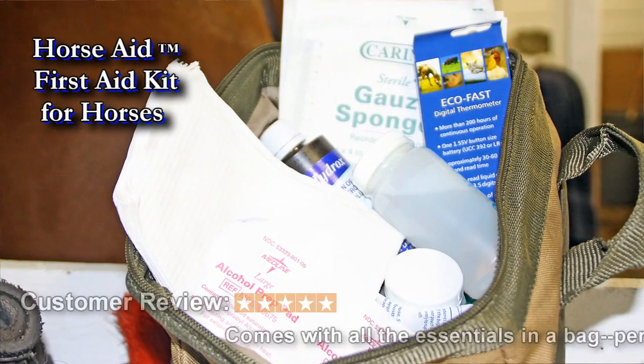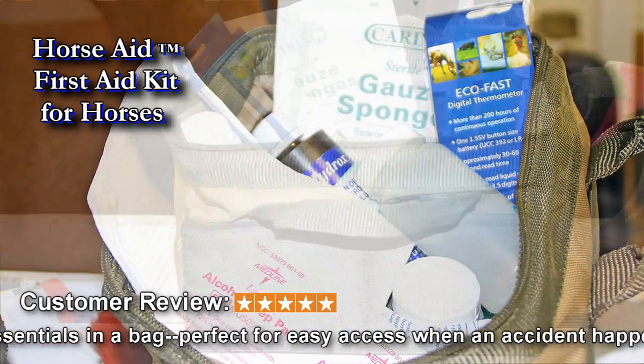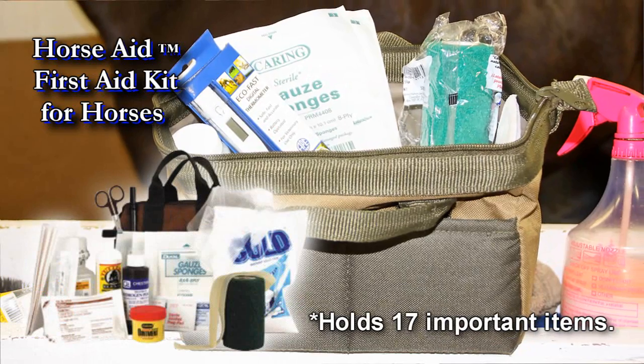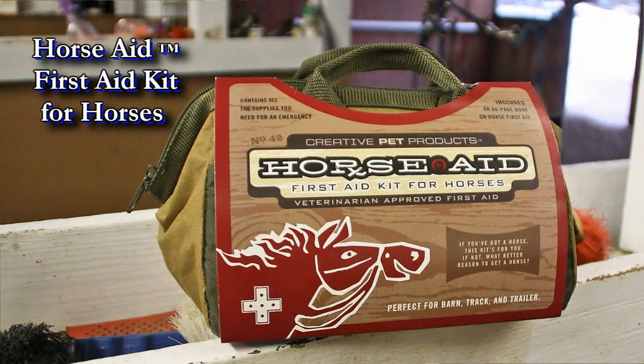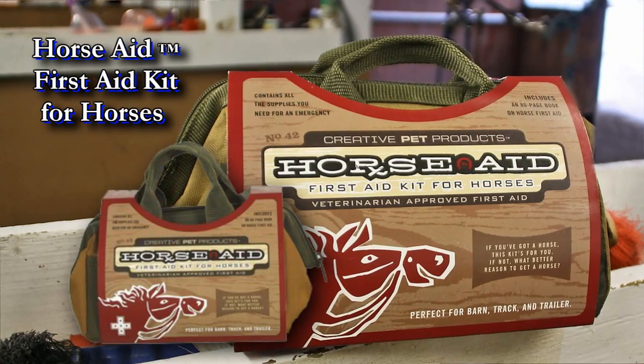The contents of the Horse Aid First Aid Kit were selected by horsemen and veterinarians to provide your immediate basic needs for injury and wound care. All 17 key items fit neatly in this tough waterproof zip-top carry bag. We recommend you keep one in your barn and one in your trailer.